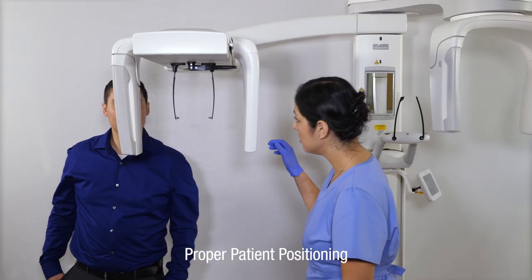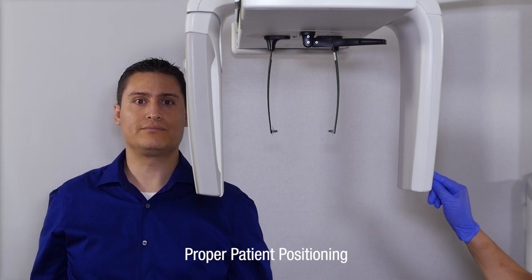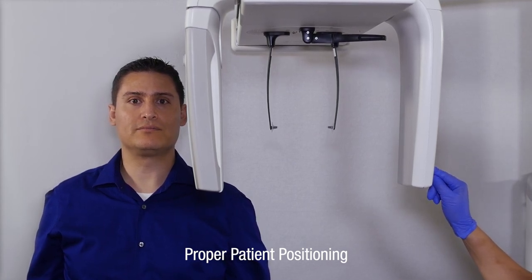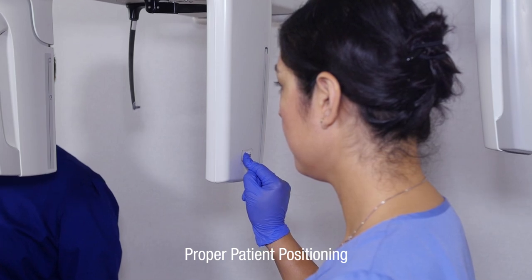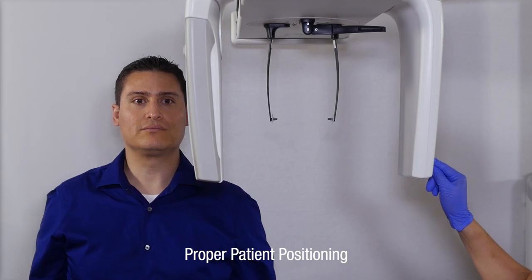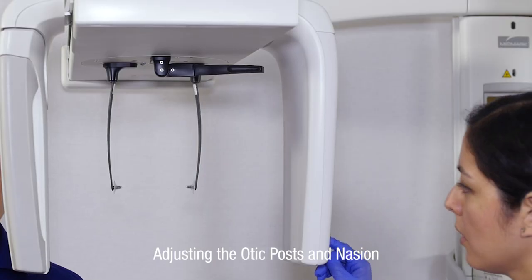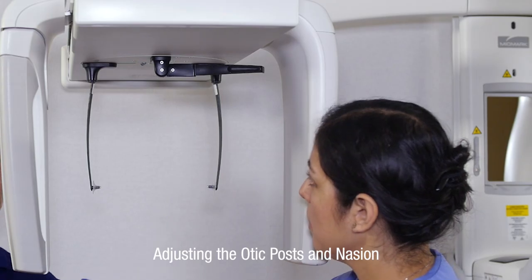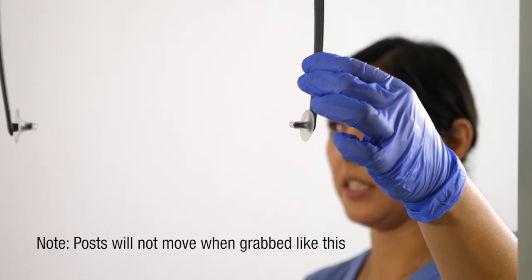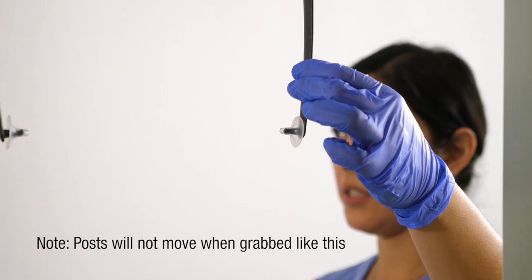With the patient standing next to the unit, visually compare the height of the patient's otic canal with the cephalostat ear posts. Adjust the height of the cephalostat until the ear posts are approximately the height of the patient's otic canal. Grasp the otic posts at the top and move them out to position the patient. The posts are designed so that they will not move except when grasped at the top.